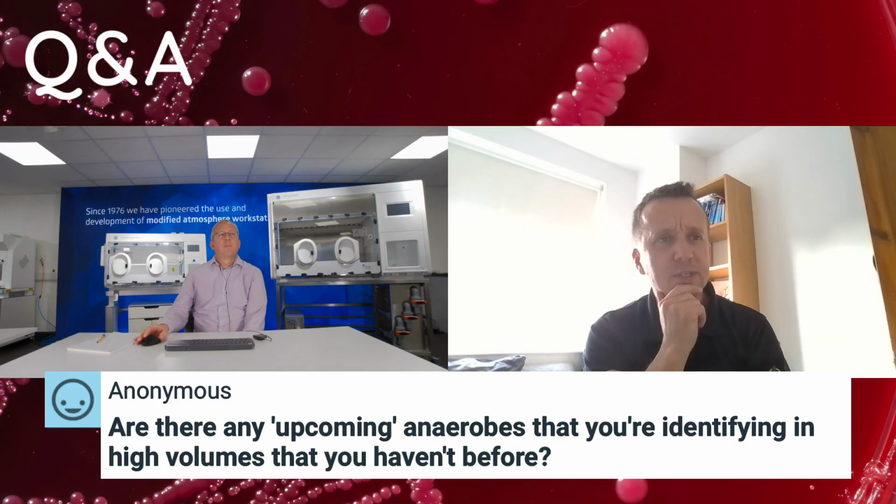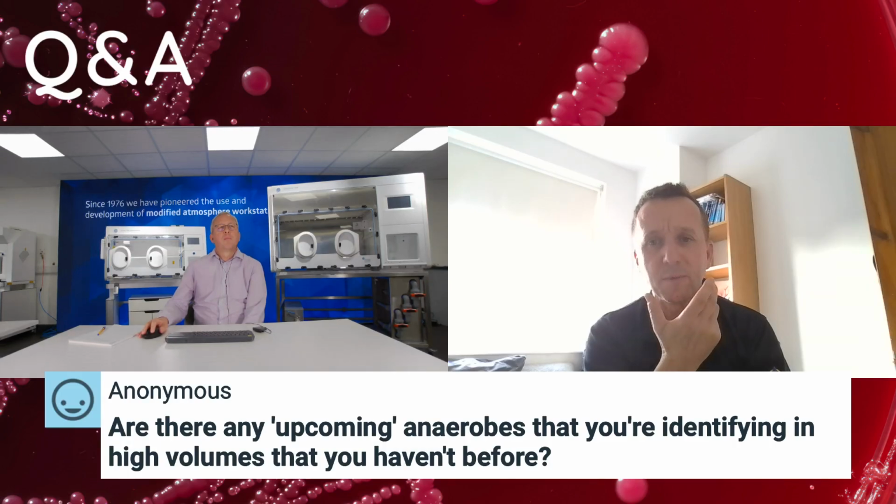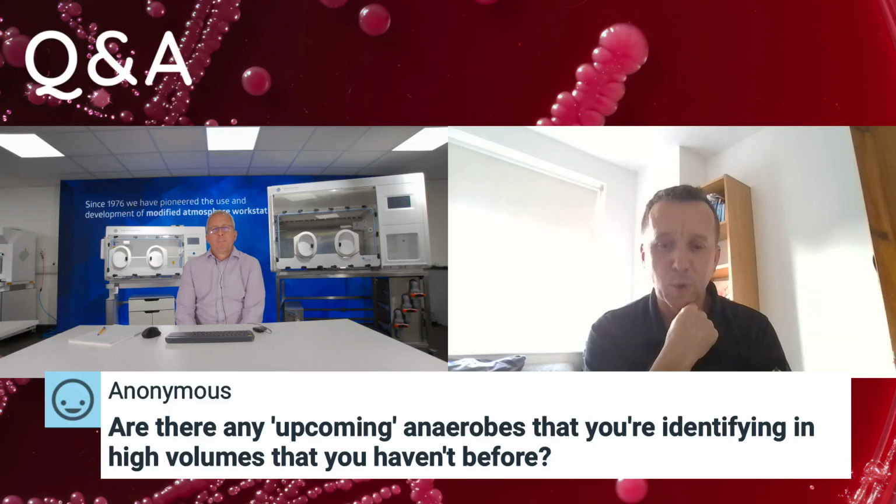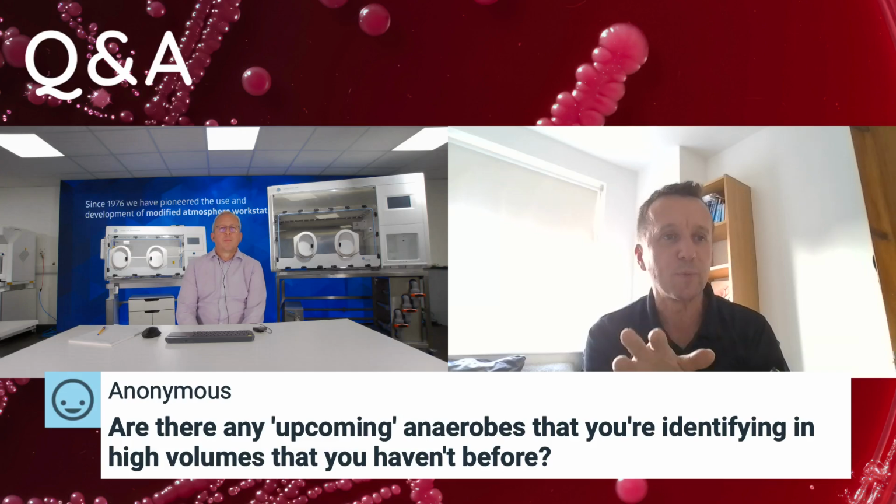I mean, we're certainly understanding more because of the MALDI, and we're identifying more anaerobes more regularly. So I would say, previously you may have sent a gram-positive rod out as an anaerobic coryneform. We're actually able to speciate a lot of those. Lots have gone into the Actinomyces genus. So we're learning a lot more that way. But I don't think there's anything that I could put my finger on and go, well, actually, we've seen an increase in people referring this.